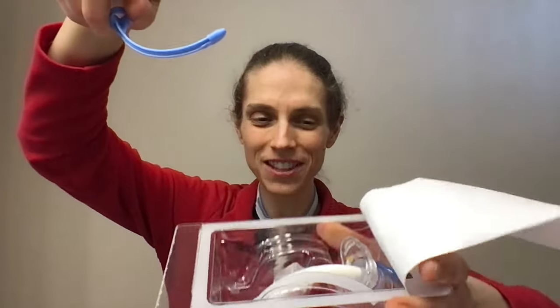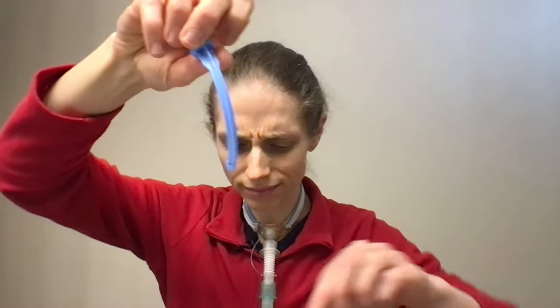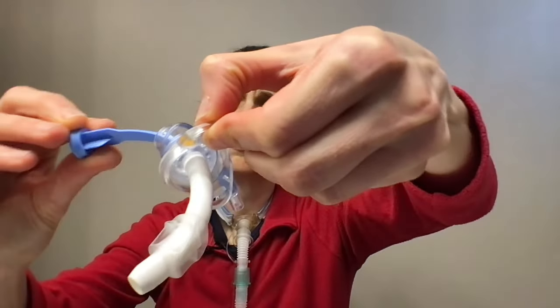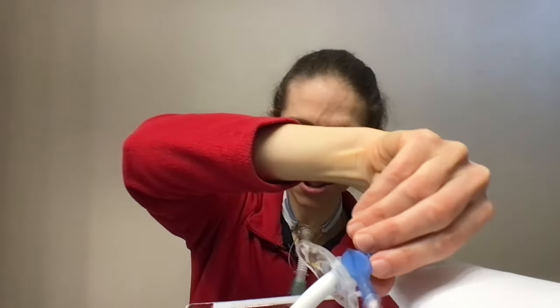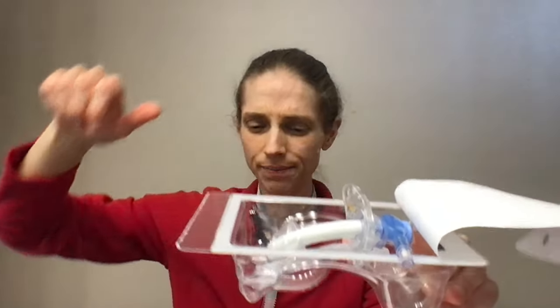Obturator is out. Now I'm going to try to get this tracheostomy tube out and put this obturator in. I did it. Oh, I'm so excited. Okay, now I'm going to carefully put this back in the tray, and I have not touched this area with my hand, and voila.